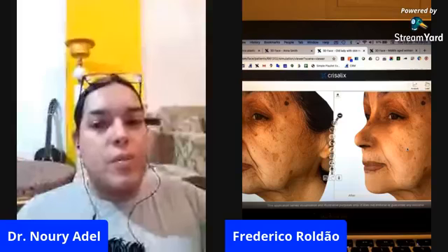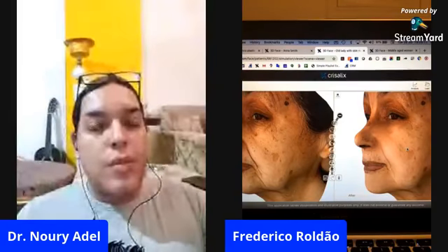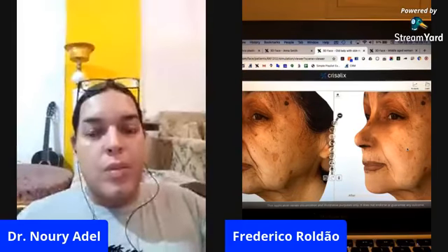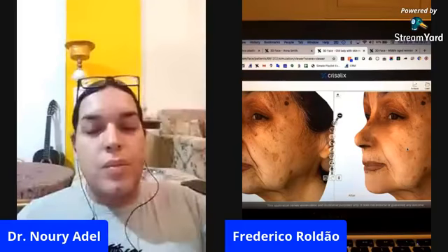Yeah, it is. And it will give you the difference. So, for instance, if you straighten the nose or change the jawline or something, it will give you the difference between one thing and the other. I see. So you will know exactly how much you've changed.